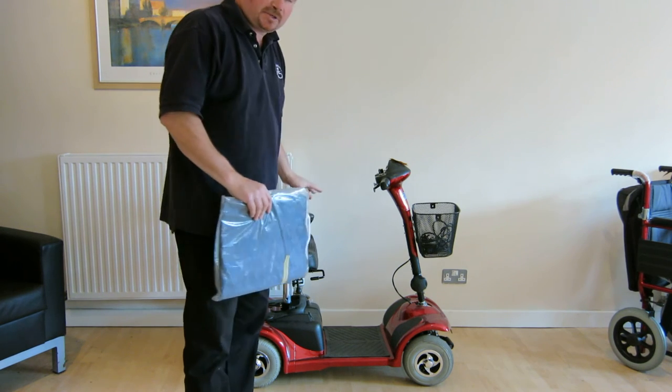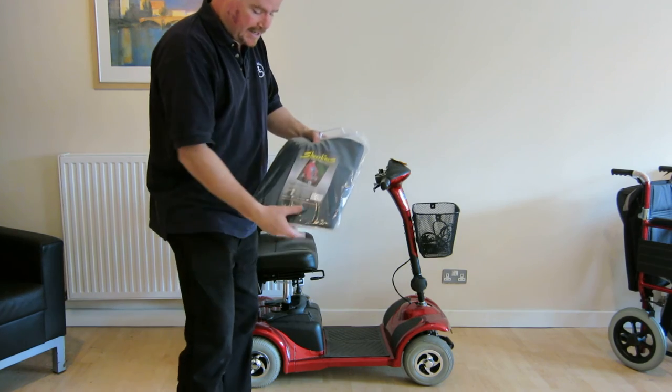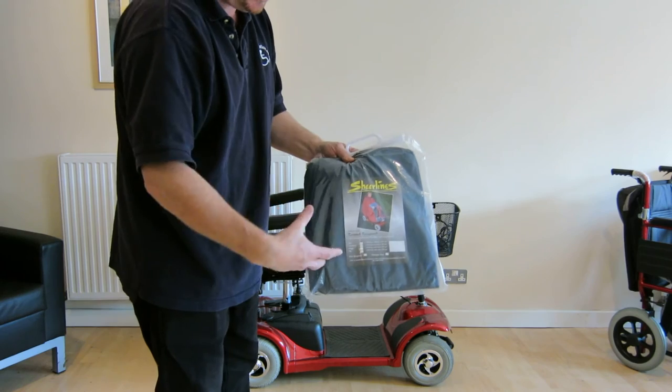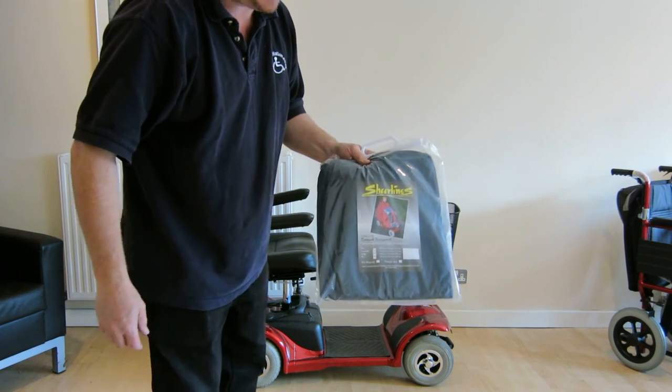It covers both the rider and the scooter, keeps you nice and warm and dry. Similar principle to the cover, it's got an elasticated bottom, so it fits quite smoothly but stays clear of the wheels. So that's the cape.